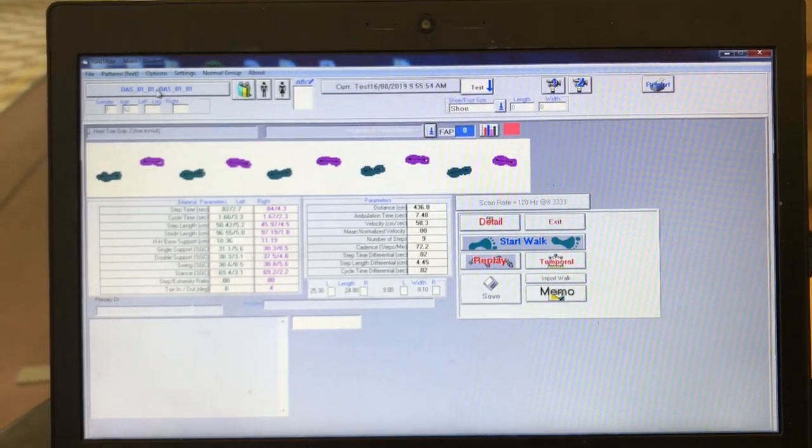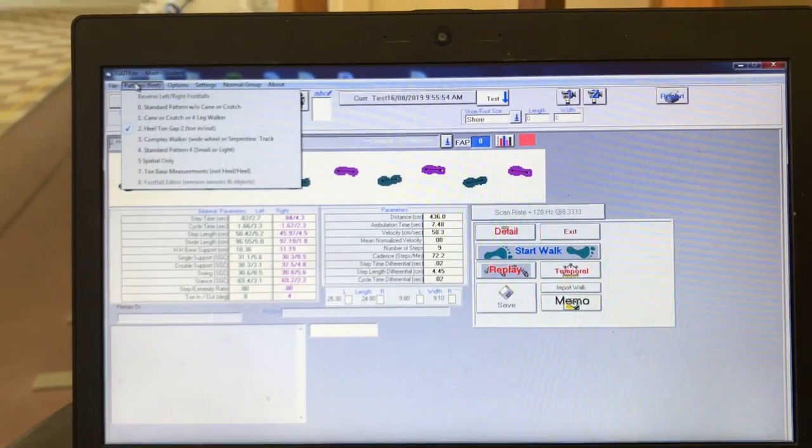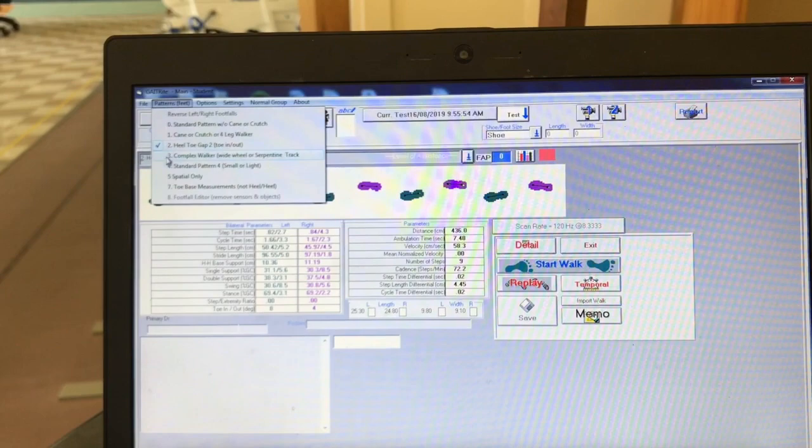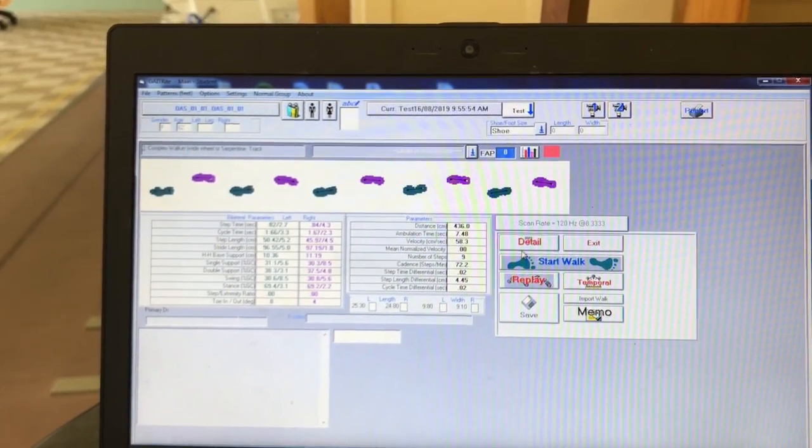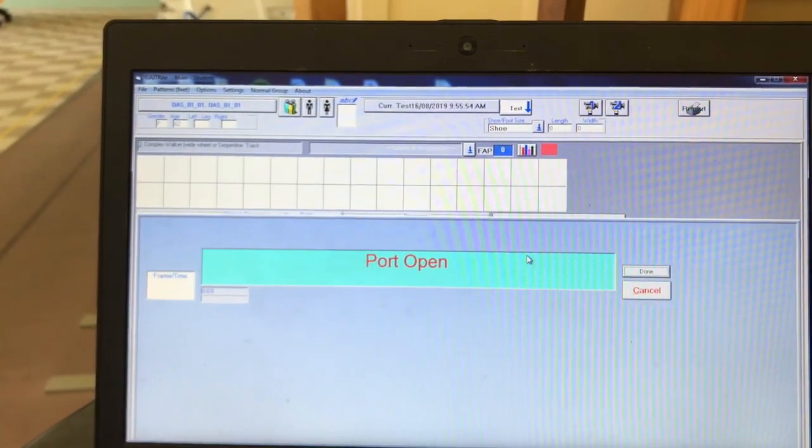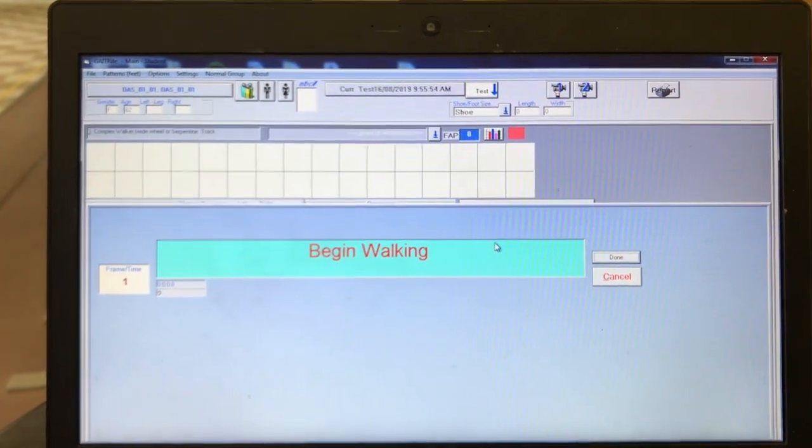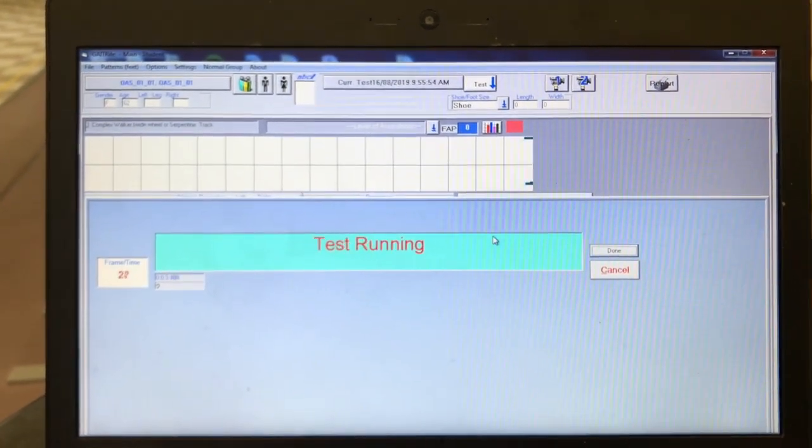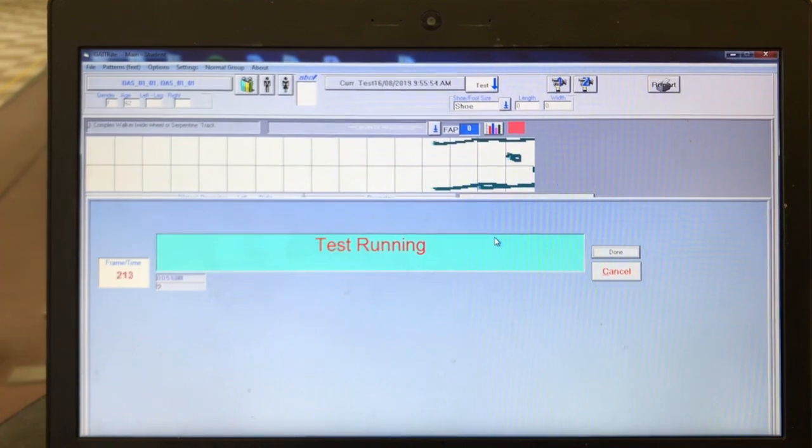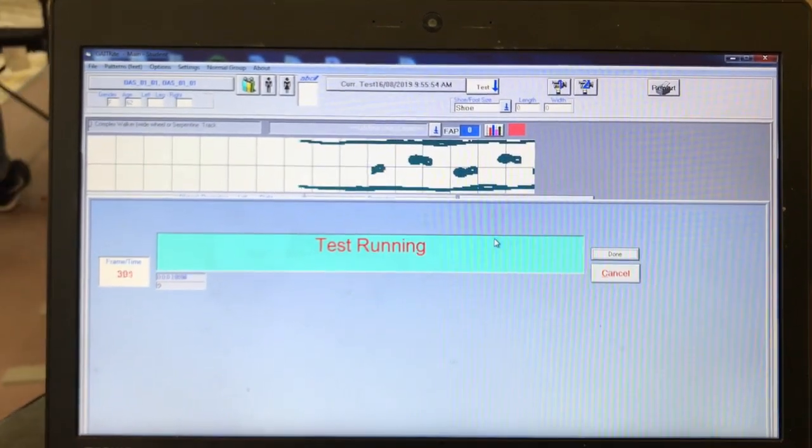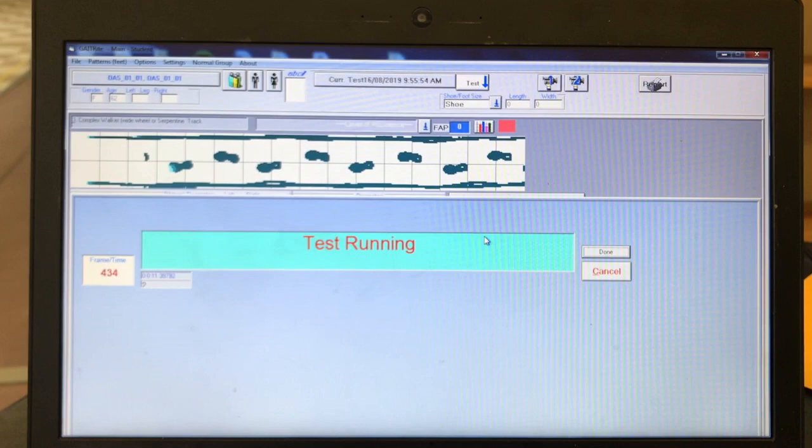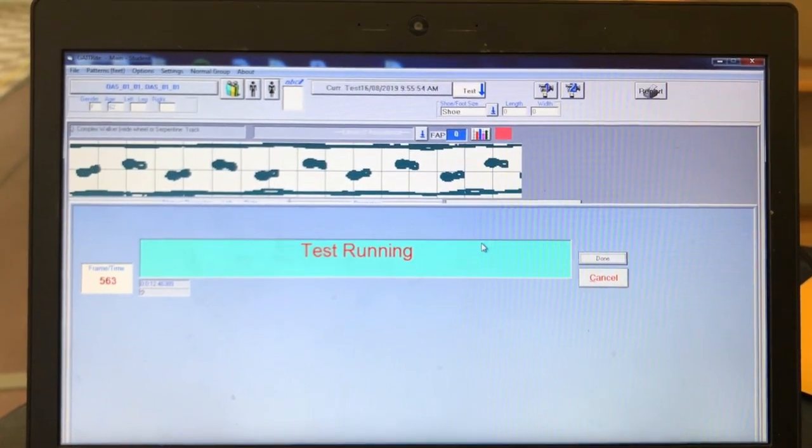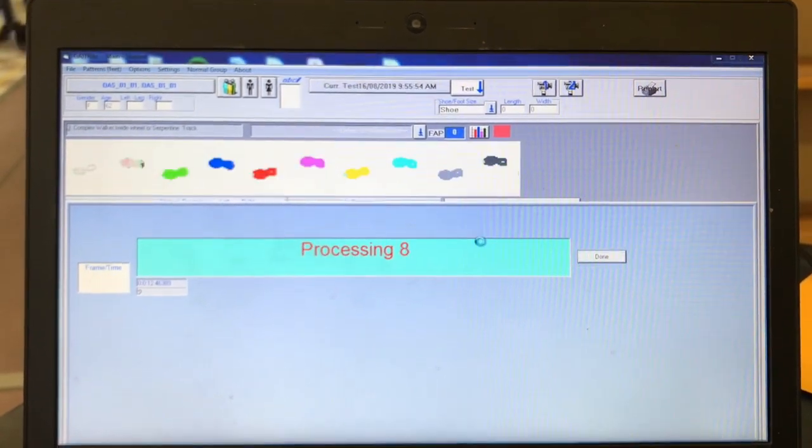Once the participant has finished the walk, you will see the gate right program process the walk and bring you to another screen displaying all of their footprints. The program will ask you to verify if the footfalls have been correctly identified. All of the left feet should be shown in green and all of the right feet should be displayed in pink. If all of the footfalls have been correctly identified, click the box in the bottom left corner saying accept as shown.